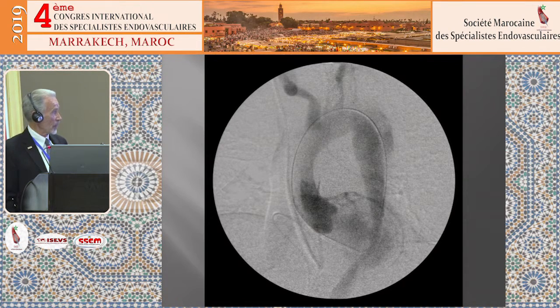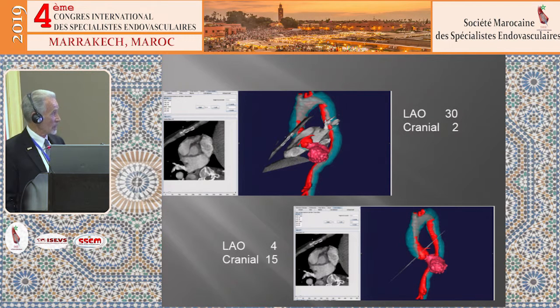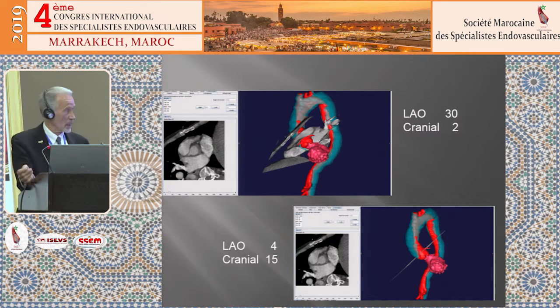This is the angiogram. You can see the dissection. We want to make sure that we can connect through to the cerebral vessels, and on an intravascular ultrasound, we look along the length of that to be able to make sure that we can see that it communicates with the head. As I mentioned, these cases then get laid out very much like it's a TAVI case. We want to be able to land here just above the coronaries.